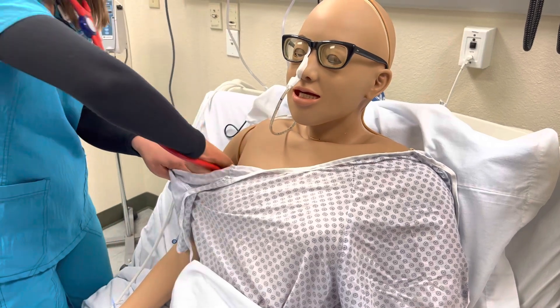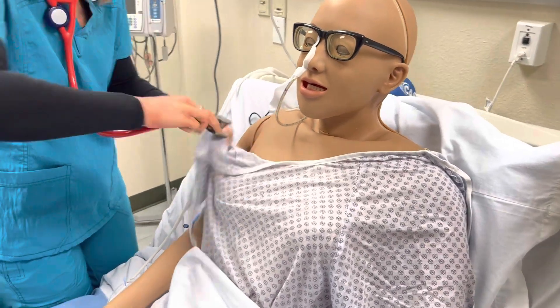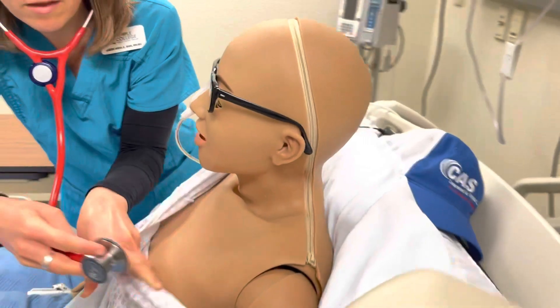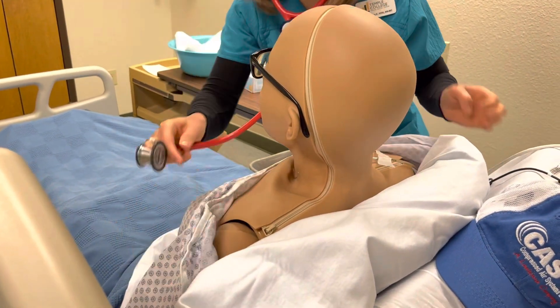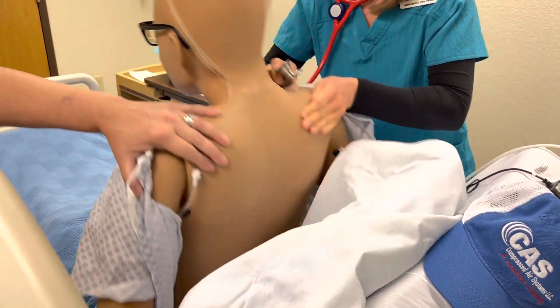We'll do four pairs on the anterior. And I'm just going to do one pair on the lateral as well.